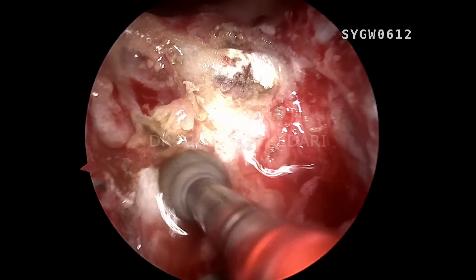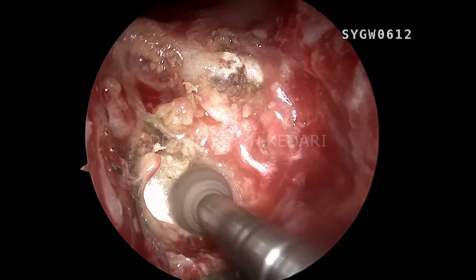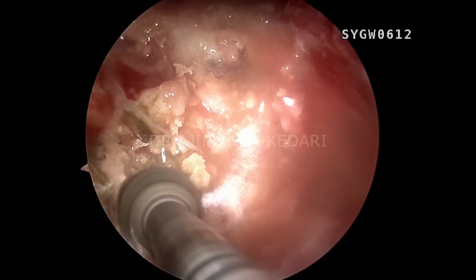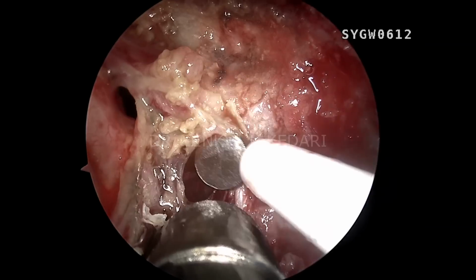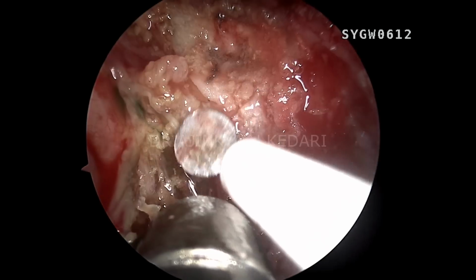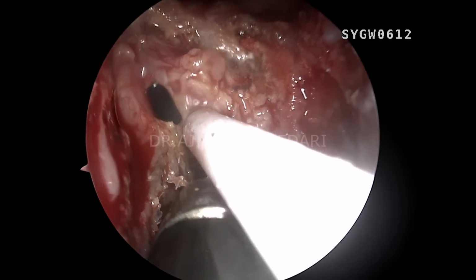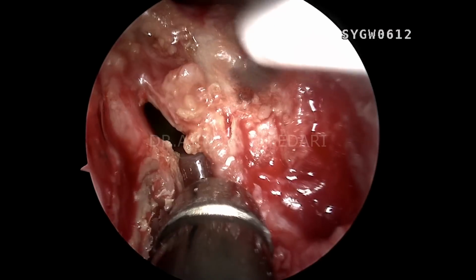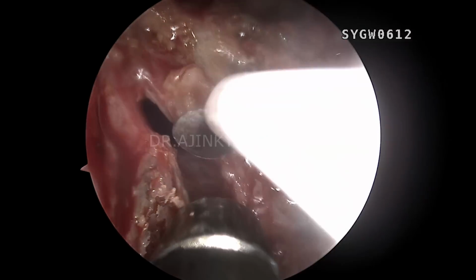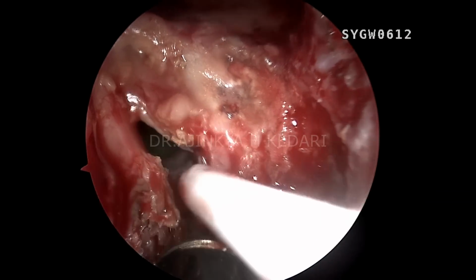If you don't drill and make it flat and you just try to plug the fat in with an angled ball probe, without drilling this, the step which I'm doing right now, had you just put the fat inside without drilling and uncovering this bony landmark, you would have had a good amount of failure rate for this patient. You can see now, after drilling on that bone, how big the defect was from within. Can you see that? This is a very huge defect that was possible to see only after we drilled that bone.